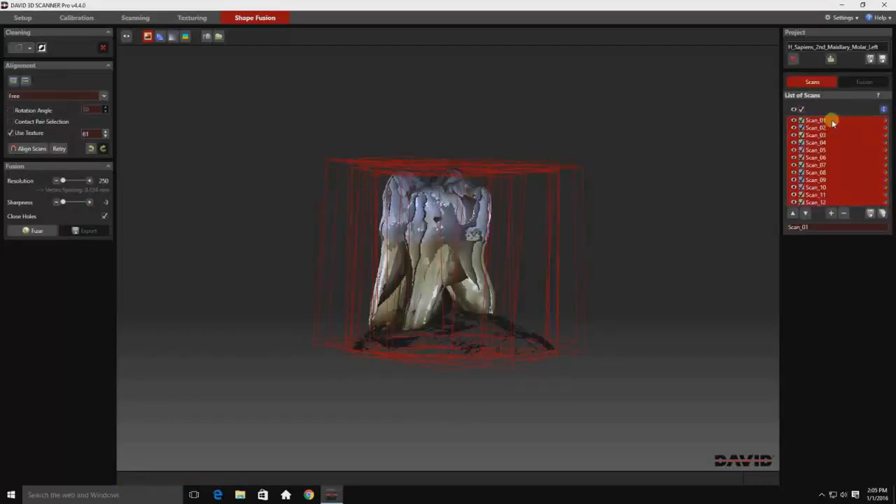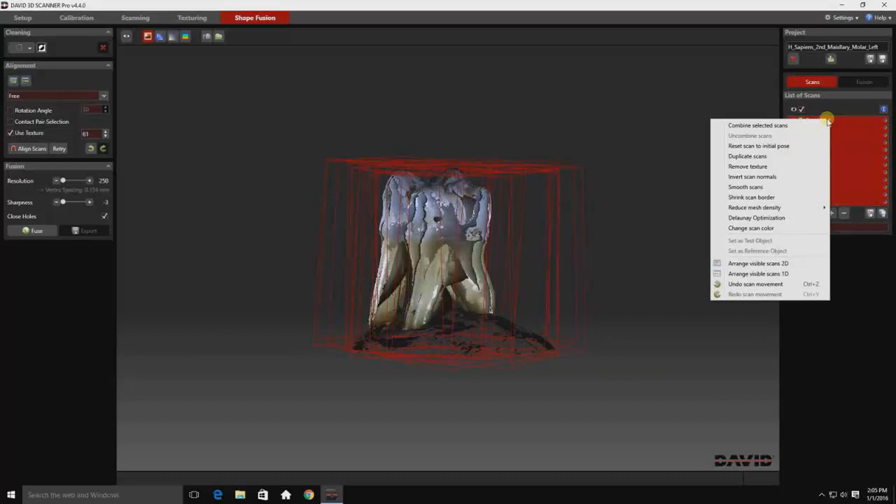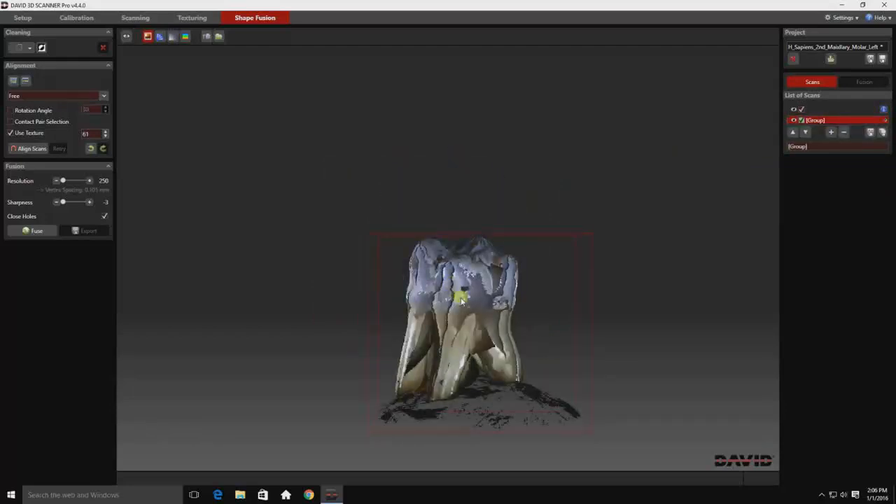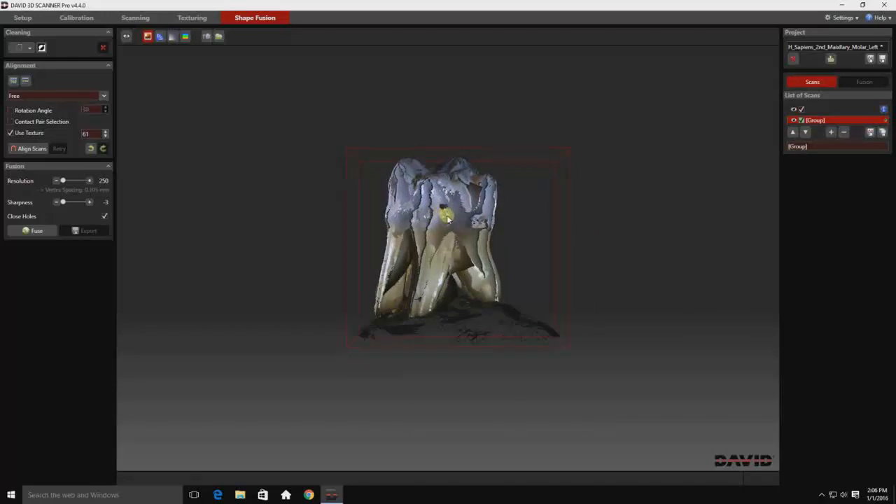Here I'm selecting all the scans and deselecting — simply toggle that switch or any of the individual switches. And now I'm combining all of those scans into one block. This gives us one set of data that can be worked with as one unit.